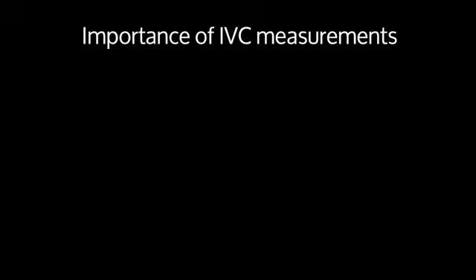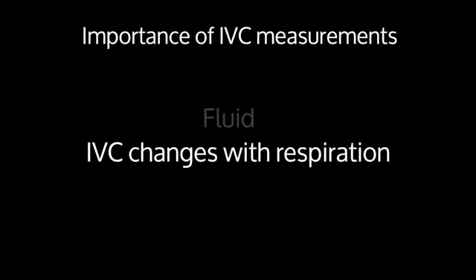Even though we talked about the 4 views of the heart, it would be prudent to also talk about the IVC, as this can help you gather more information that is very important about the patient's fluid status. In a nutshell, IVC measurements are important because they help guide fluid management. The respiratory cycles correlate with changes in IVC diameter in someone that can receive fluid, giving estimates of CVP.